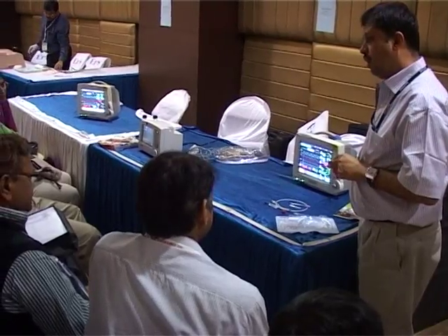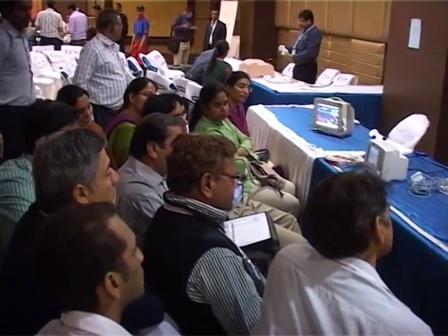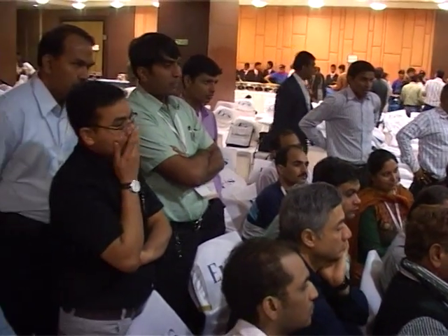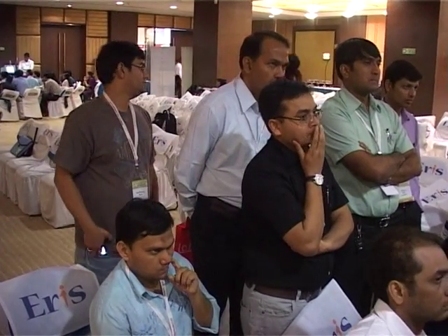6.3 liters. It was showing 5.8 there, but as it is a continuous cardiac output, depending upon the stroke volume variation, it is changing beat to beat. So the machine takes an average of 4 to 5 contractions, it's 5.7, and this is the biggest advantage we have in terms of our previous technology of Swan.